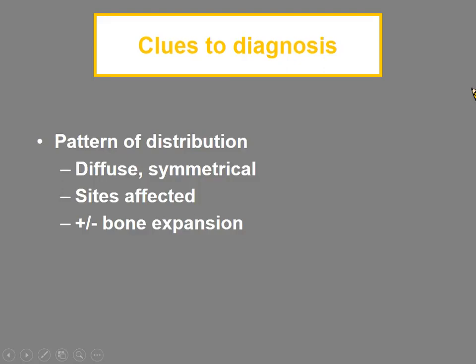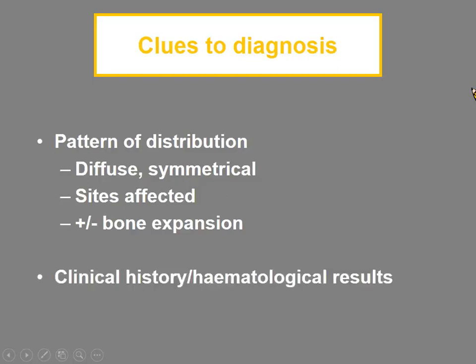And in chronic cases, as we've just seen, you may also encounter bone expansion. And in this day and age of electronic records, it is always useful to confirm this by looking at the clinical history or the hematological results.